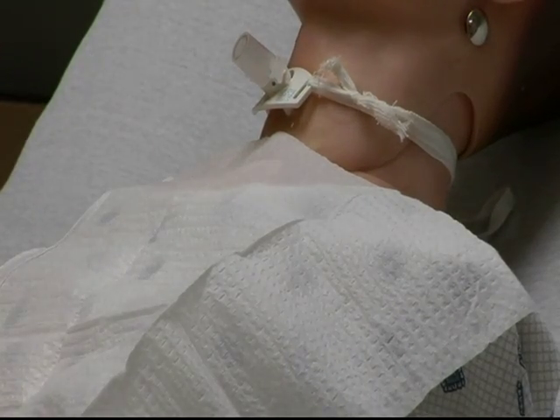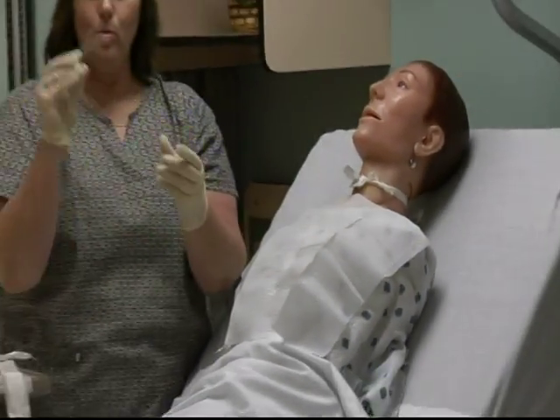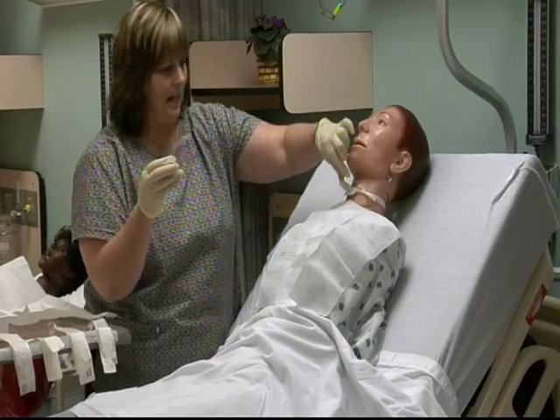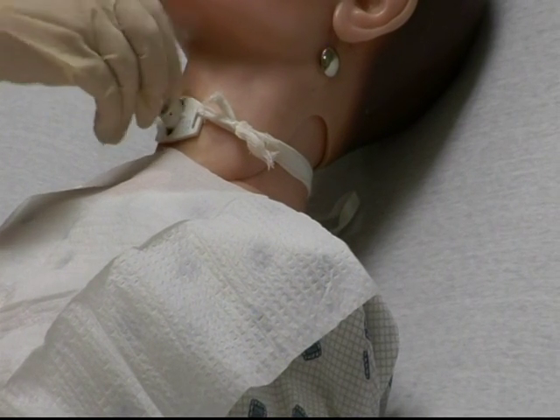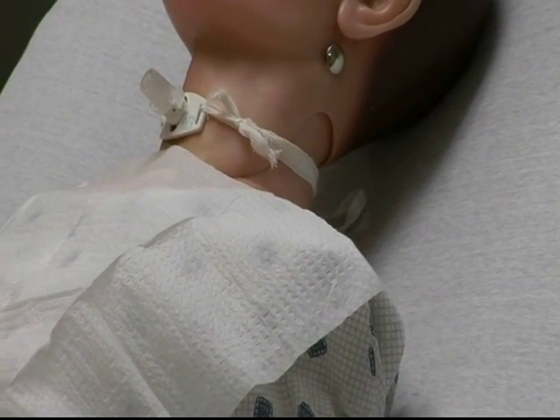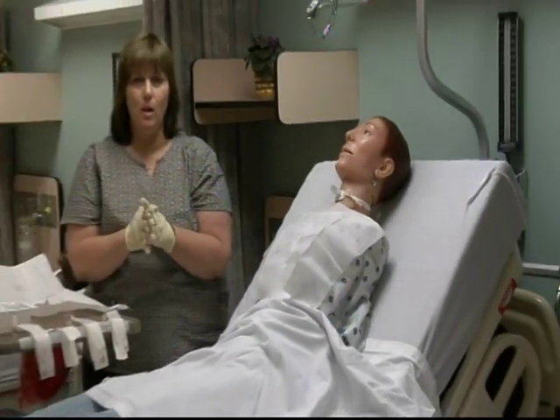Clean it real good. Now, go ahead and pick up your sterile inner cannula, and with your non-dominant hand, take out this old cannula, place your new inner cannula in there, and clamp it on, and then this one goes in the trash. Now, your sterile procedure is over.